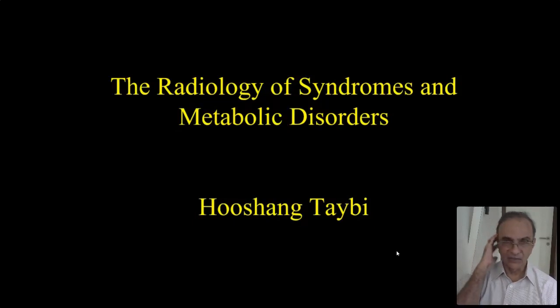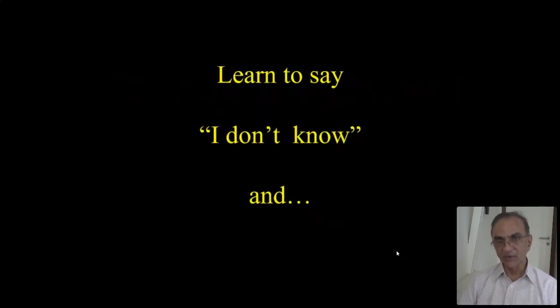And you should be able to look at the clinical findings. So this is optional extra. If you feel like it, you look this up. The easy way may be to take a picture of this and do a Google image search. Who knows, in 5 years from now, Google image search will tell you the diagnosis of a skeletal dysplasia. Okay, then this one. And learn to say, I don't know.